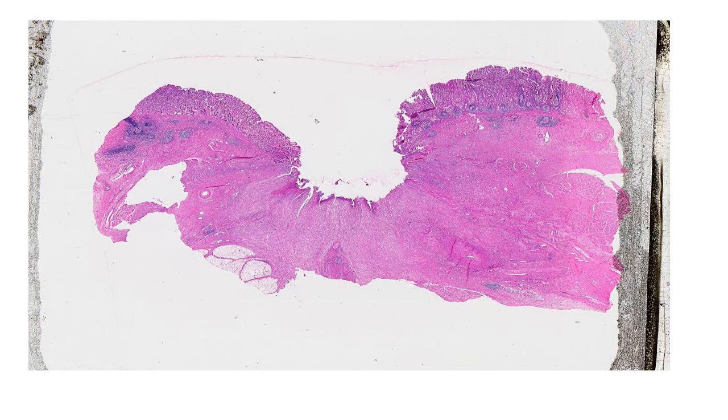And today I'm going to talk to you about this slide, which is a stomach ulcer. The first thing we want to do when we take a look at this slide is review where we are. We're in the GI tract. There are 4 layers in the GI tract, particularly in the stomach.